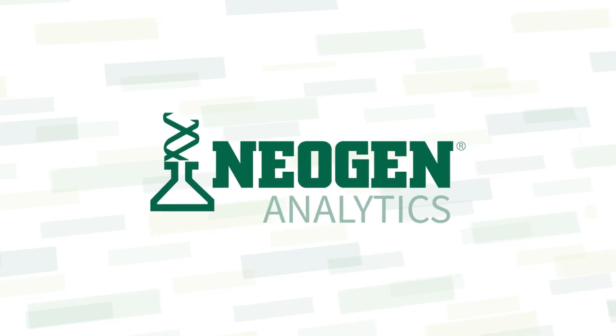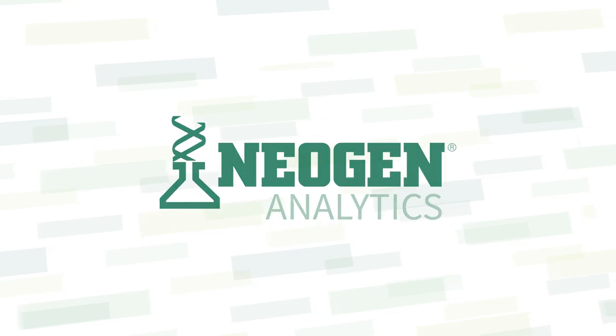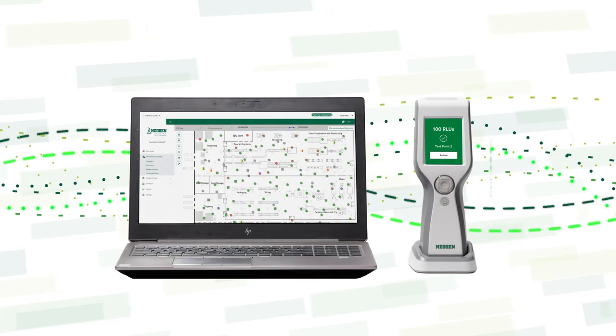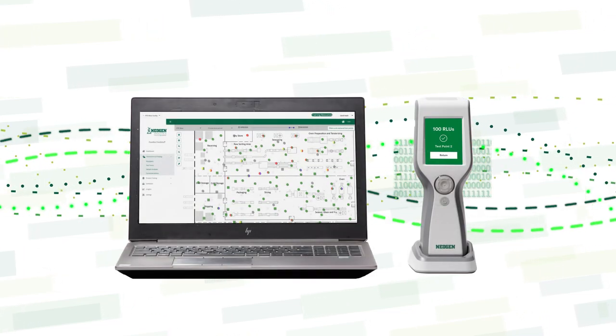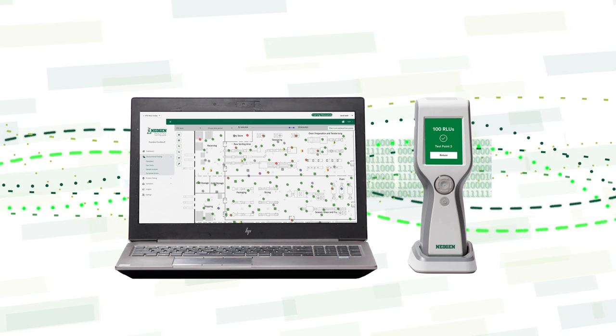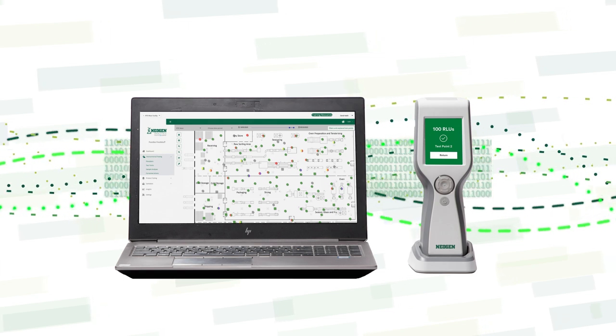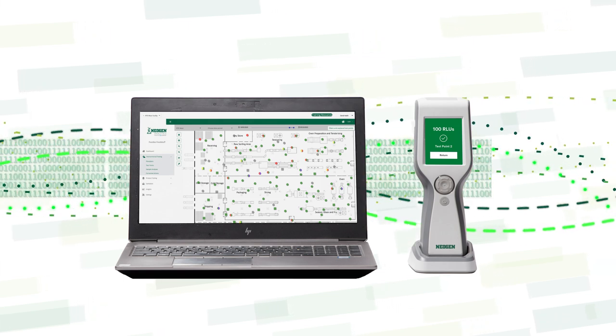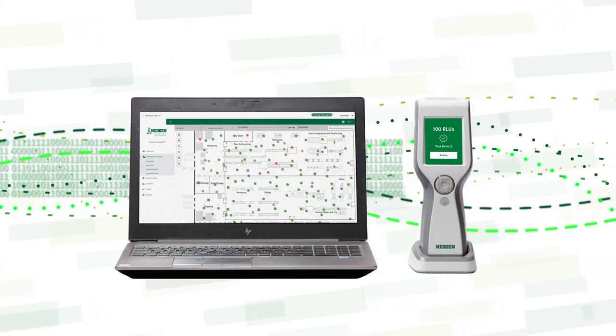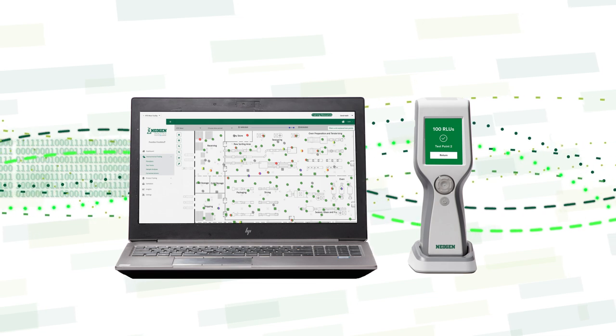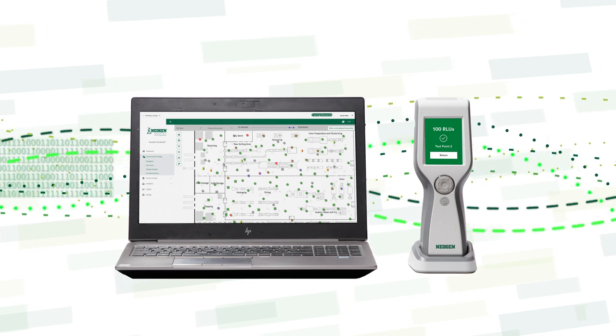Welcome to your new Neogen LM1 ATP testing device connected to Neogen Analytics Essentials, the most advanced hygiene testing solution available today.